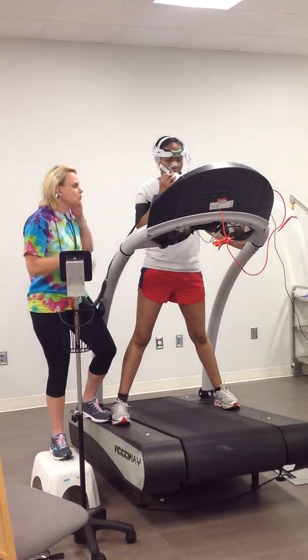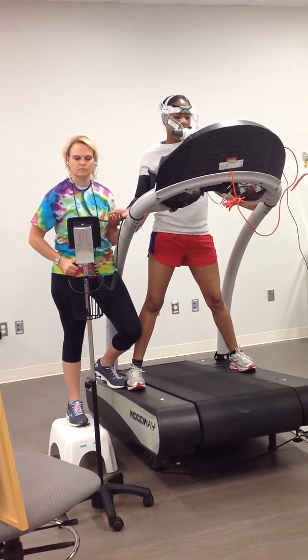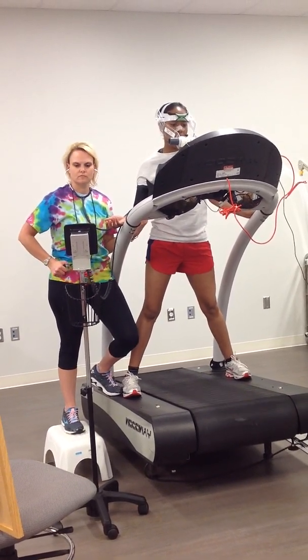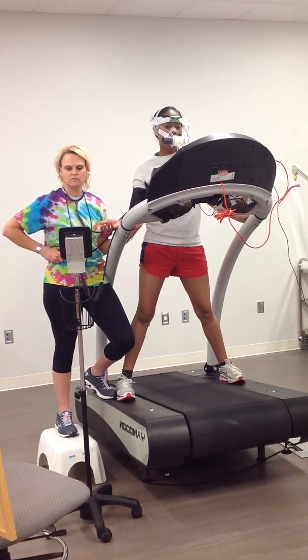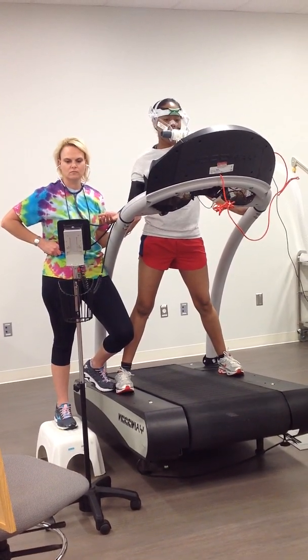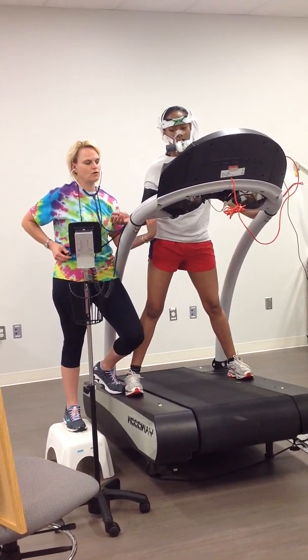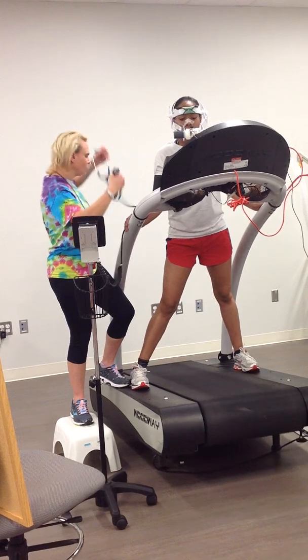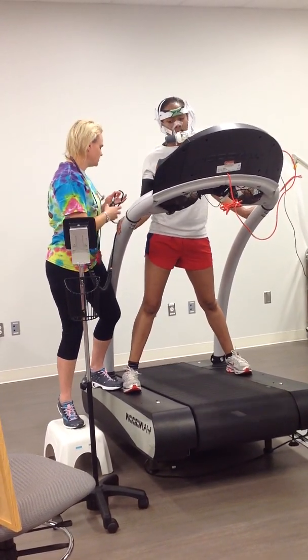Total time was 7 minutes 37 seconds. Blood pressure was 144 over 84, heart rate was 194. RPE average was 17.